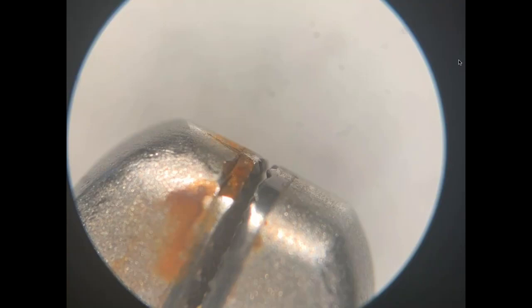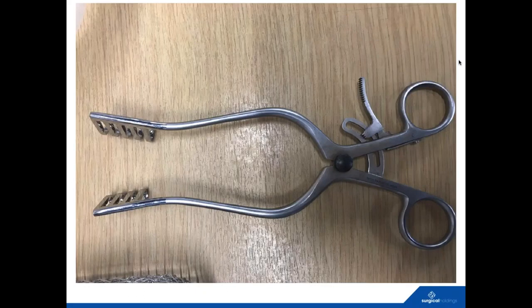So not only is the tip damaged, and it's probably not going to perform particularly well when you're holding the needle, but you've also got the added issue there of rust forming, of course, as well. So yeah, not ideal. Being able to spot variations in materials. So this is a retractor that we saw on a set.